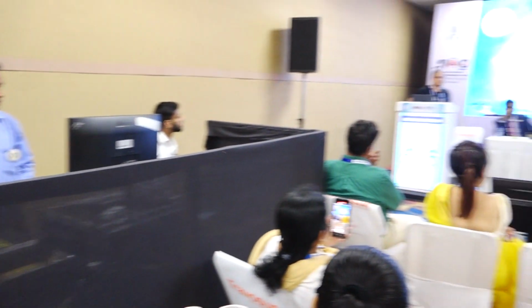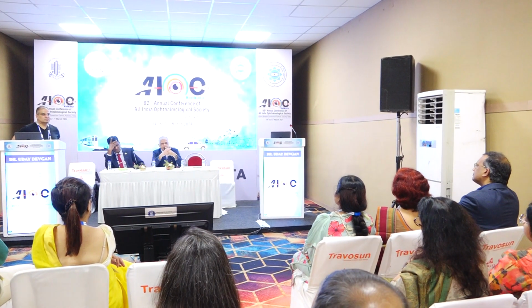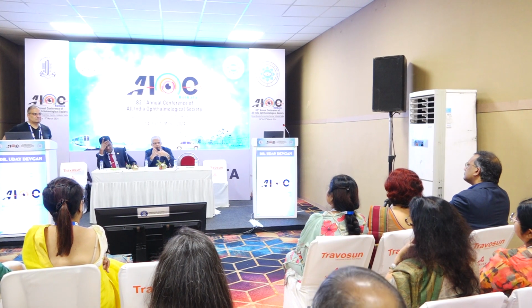Is it a free platform? Right now it's free, IOLcalc.com. It's a free platform. So now what we have to understand here is a very important message given by Dr. Uday: for any patient, you're not going to rely only on your biometry value. The 0.5 diopter variation he showed is a residual refractive error. It's a huge chunk. It's going to be translated into millions of patients, and patients are not going to accept that, because of the more usage of premium intraocular lenses and some other factors.